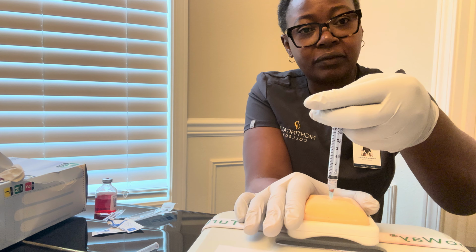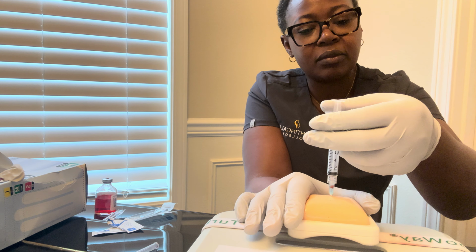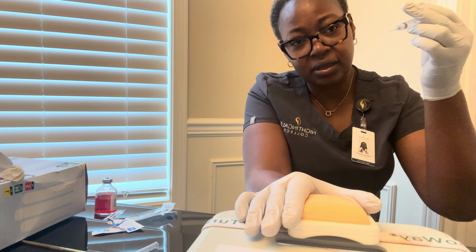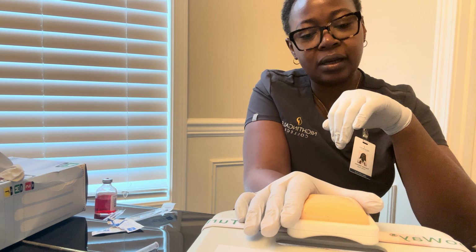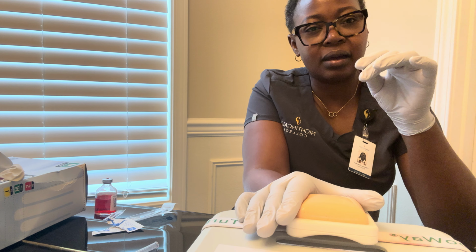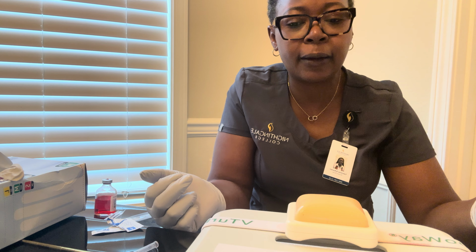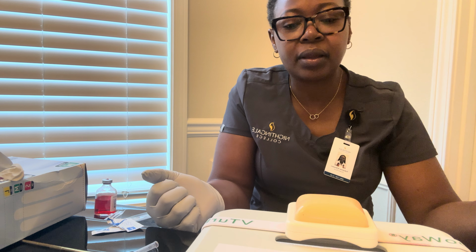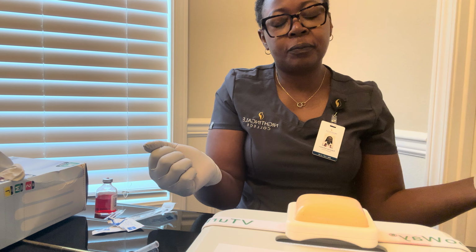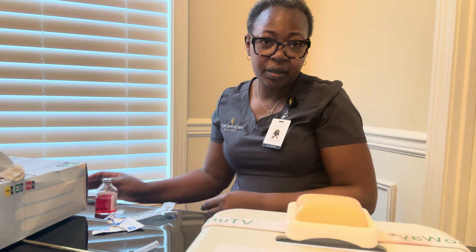And then I'll wait a little longer for the medication to get into the muscle. Then I will remove, and I don't want to recap this, so I'll put it in the sharps. I don't want to massage, and maybe I can apply pressure just in case I see anything oozing, but the skin looks nice and okay. So I'm not going to massage, I'm just going to wait for maybe 10 seconds to see what will happen. So then I will go ahead and remove my gloves, perform hand hygiene, and document. Thank you.